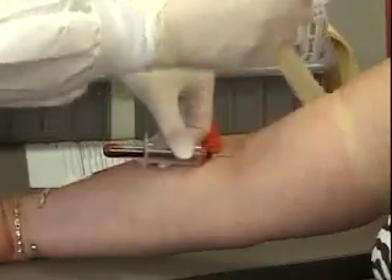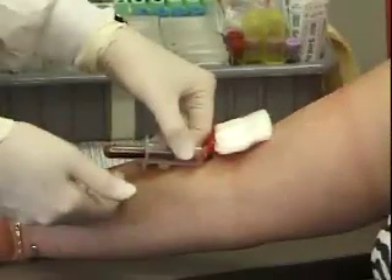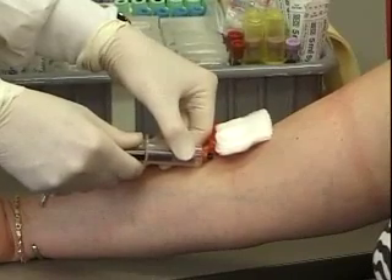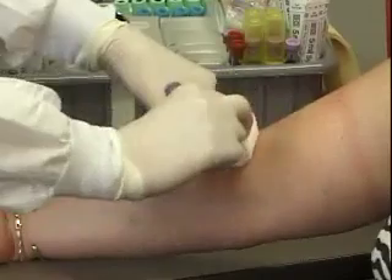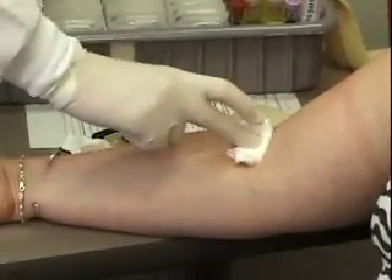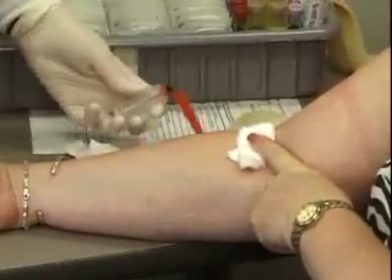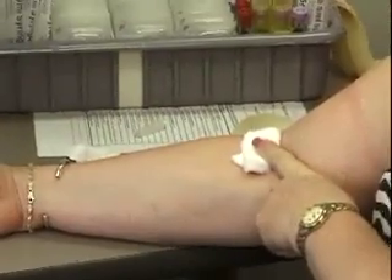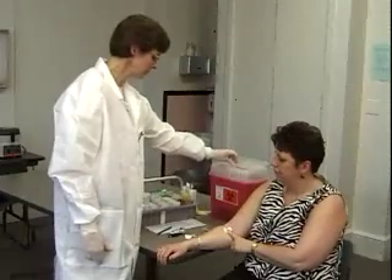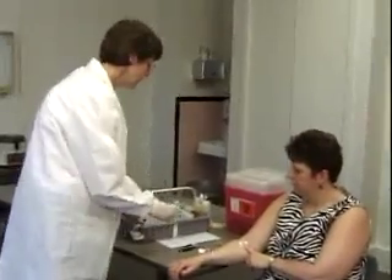I'm going to release the tourniquet while my last tube is filling. I'm going to lay some gauze over the needle, take the last tube off before withdrawing the needle, then apply pressure and withdraw the needle swiftly. Now make sure that you snap the safety device on the needle so it's totally covered, and then dispose of it in a contaminated box.